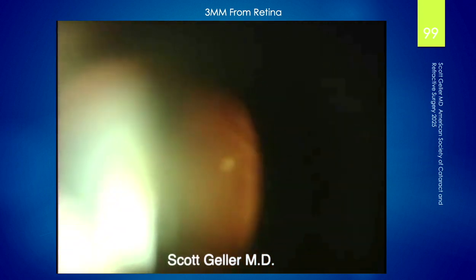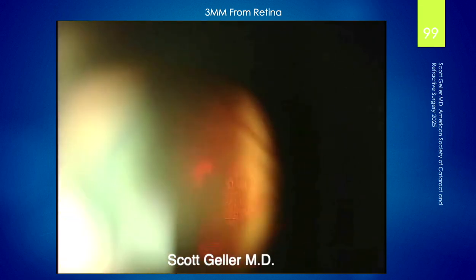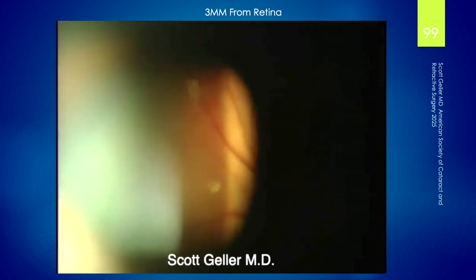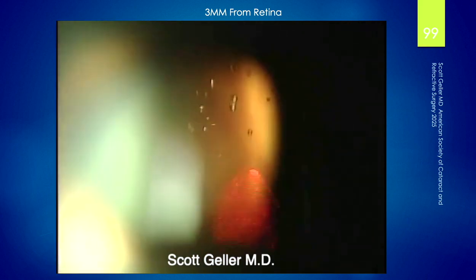I did have a case of a young patient who had a peripheral opacity. Trying to get it did cause a bit of a thermal burn to his retina. Although that was way peripheral, he perceived it as a slightly blue spot in the periphery. It was very upsetting to me. I just refunded his money and said, you know, I'm sorry about this. That might heal up with a little time, but I can't do anything about it right now. Nobody likes to see complications, especially in cases where they're young patients.